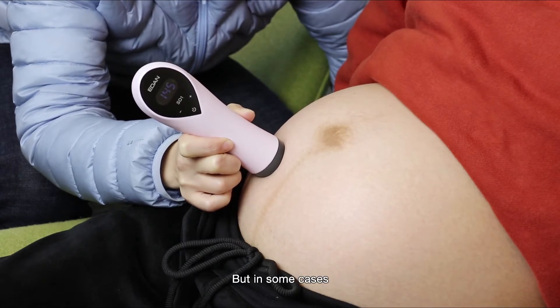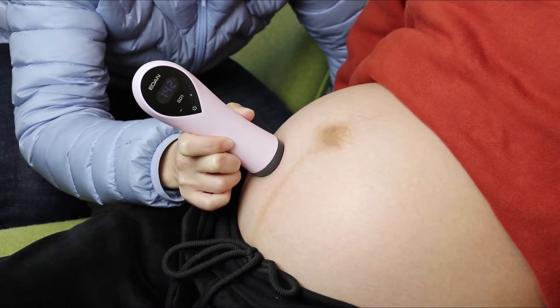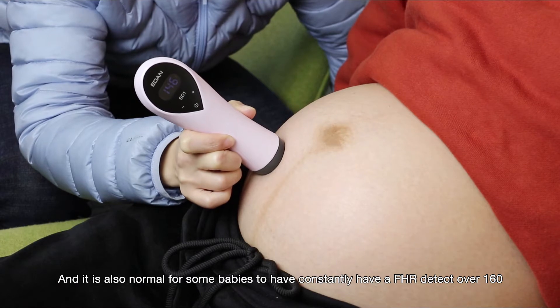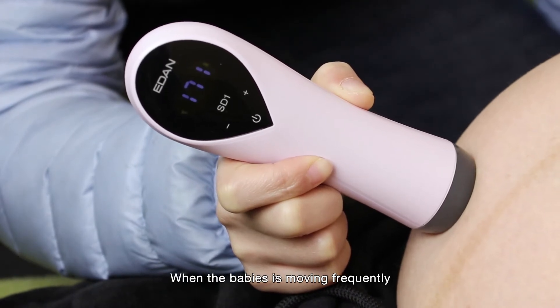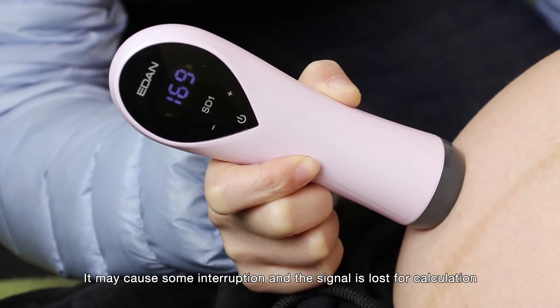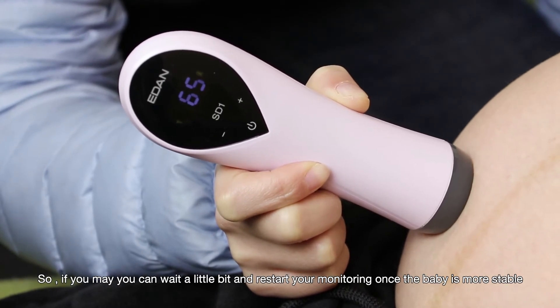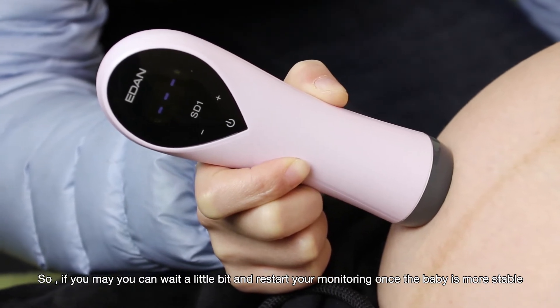In some cases, the number may be above 160 due to early gestation, and it is also normal for some babies to constantly have a heart rate detected over 160. When the baby is moving frequently, it may cause some interruption and the signal is lost for calculation. You can wait a little bit and restart your monitoring once the baby is more stable.